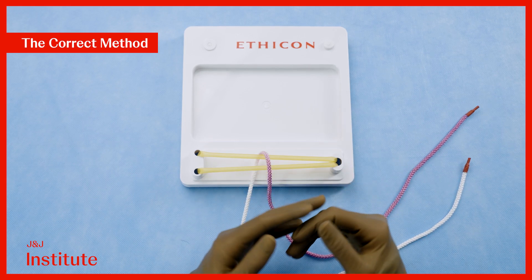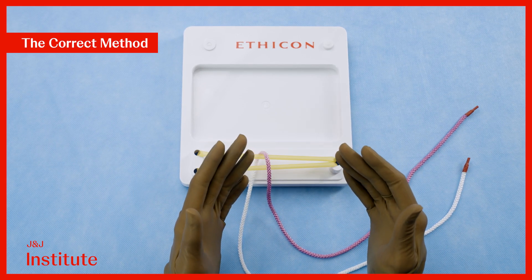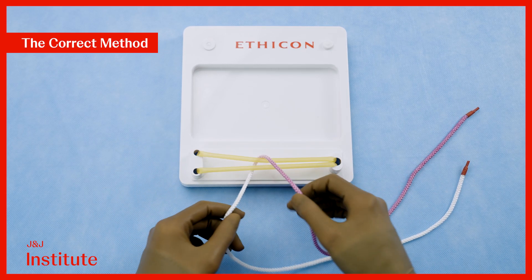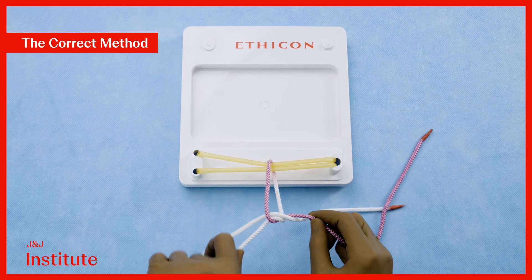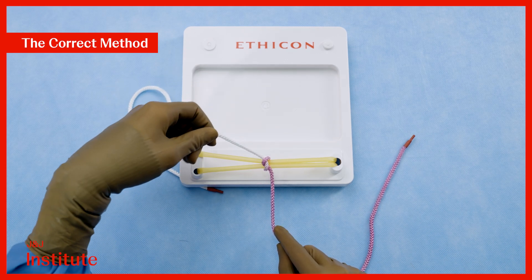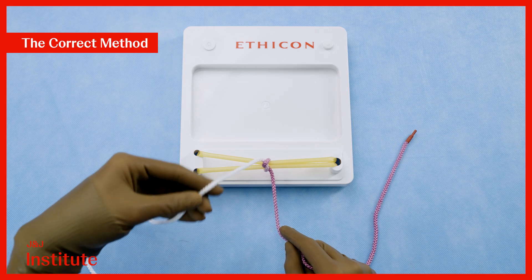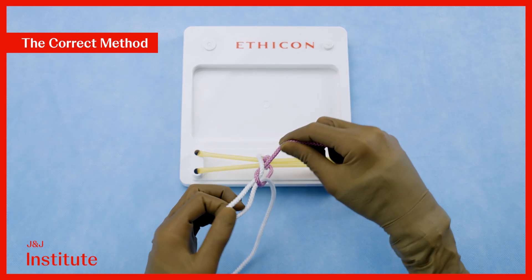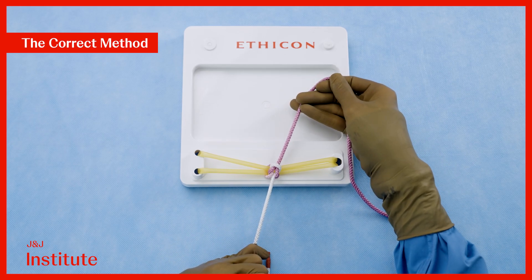Let's review the correct method for left-handed knotting. Remember, the type of throw depends upon the thread that you hold in your active left hand. Here I have the down thread, so I perform a going up throw and cross my hands such that the down thread now lies up. This half hitch lays flat. Since I now have the up thread in my left hand, I perform a coming down throw with my left hand and cross my hands to create a secure reef knot.